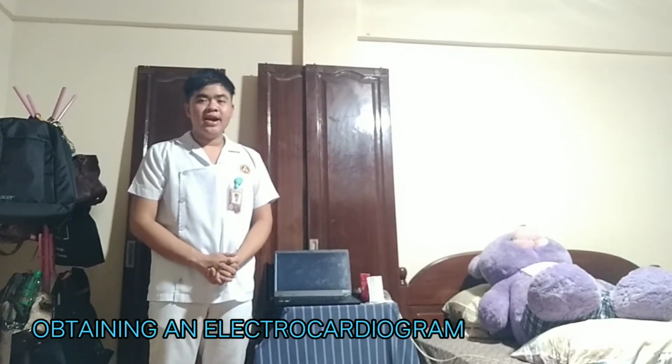Evaluation checklist: performing the obtaining of an electrocardiogram. An ECG is a test which measures the electrical activity of the heart, whether or not it is working normally. It also records the heart's rhythm and activity on a piece of moving paper or a line on the screen.